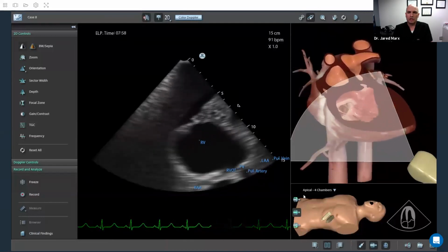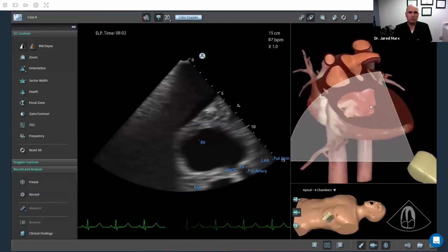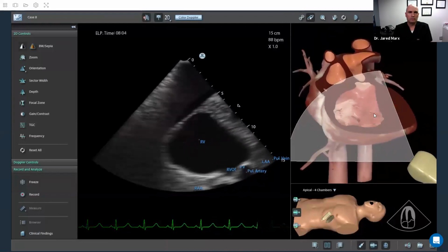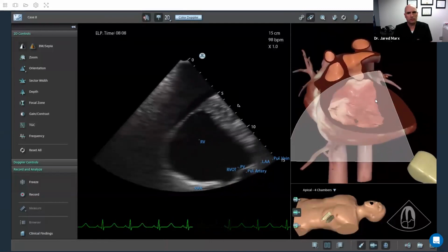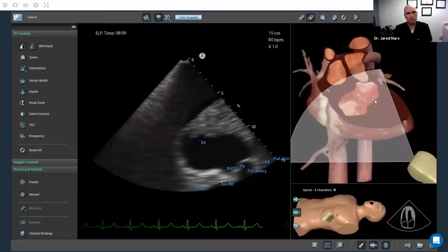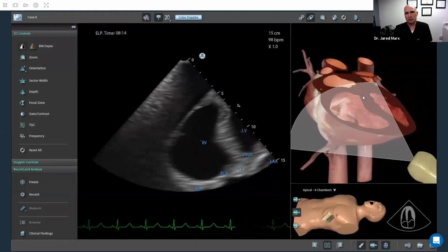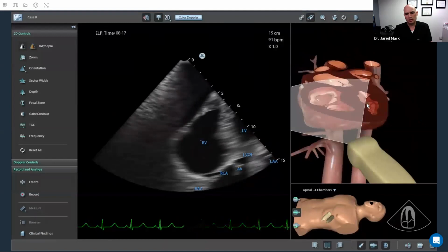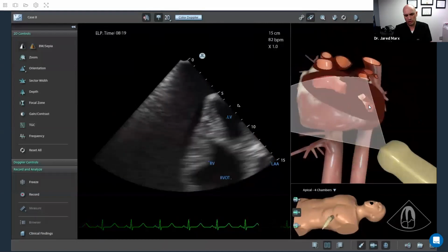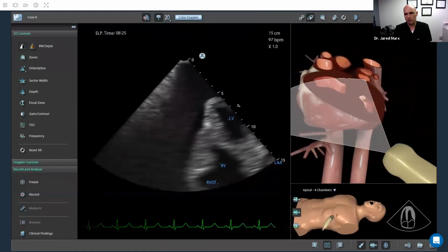One of the limitations for learners using ultrasound in front of people is that they struggle with the machine or the anatomy, and then they feel uncomfortable, and that prevents them from doing studies. So using the simulator, especially in OB, is helpful, and that's how we teach the students. OB is on the simulators, so very helpful.